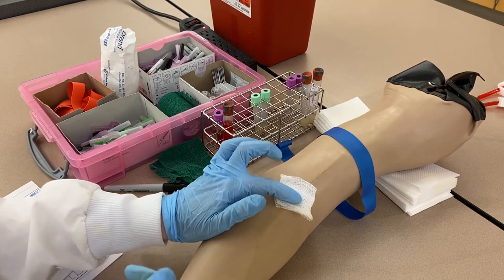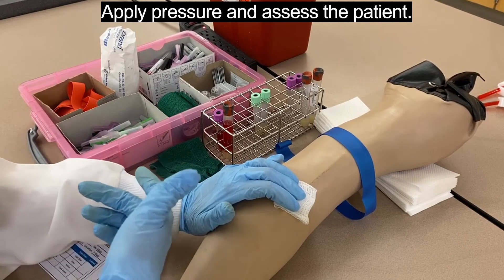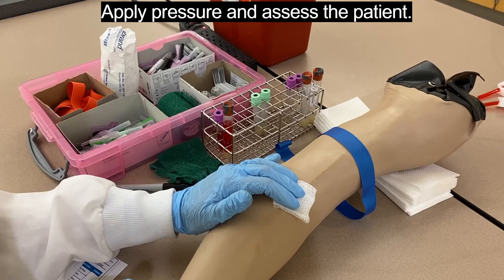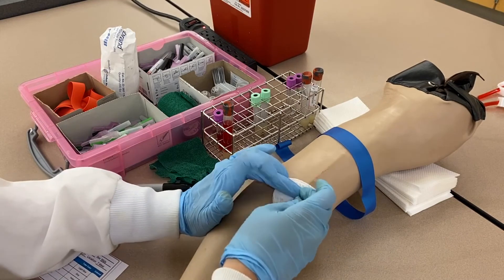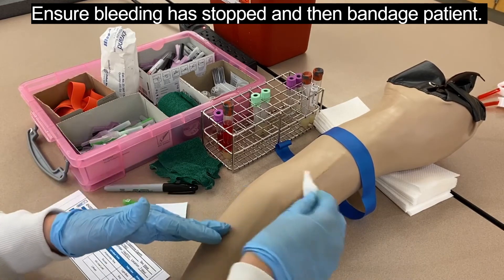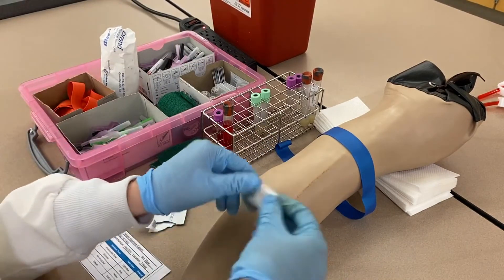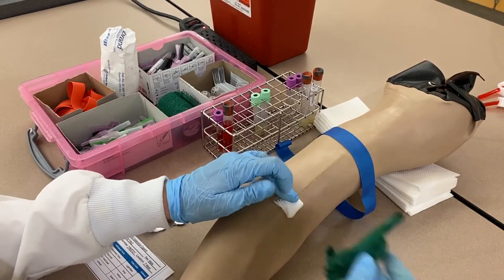Apply pressure to the site. If the patient is conscious, they can apply pressure themselves while you label the tubes. Take time to assess the patient — ask how they're feeling — because patients can have vasovagal reactions after the draw and become lightheaded or nauseous. Before bandaging, make sure the site has stopped bleeding. Some patients are on anticoagulants or blood thinners, so it may take longer. Continue applying pressure until bleeding stops, then change to a new piece of gauze folded into a small square so the bandage adds additional pressure to prevent reopening the puncture site.